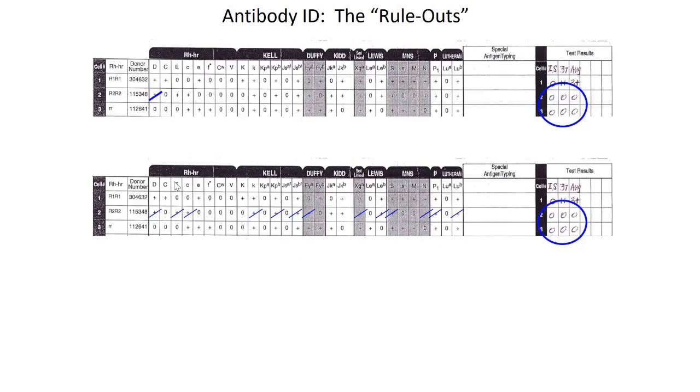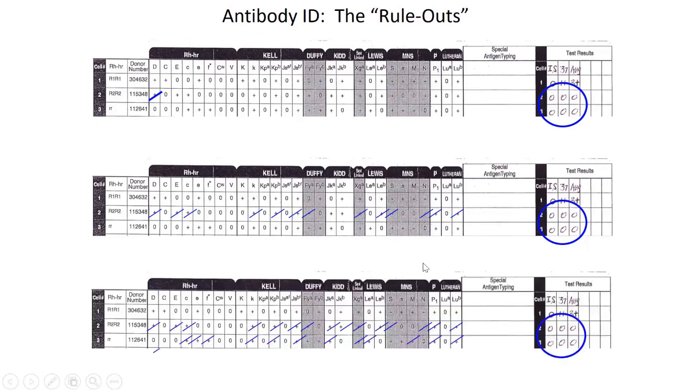Likewise, the fact that the cell is big E positive and little c positive means that these are doubtful to be targets. And so again, this is how you do rule outs. And in the last step, the little r cell has little c and little e ruled out, as well as a couple of other things like M.